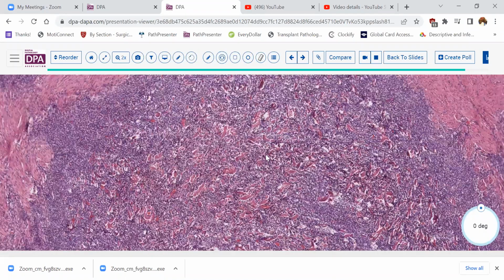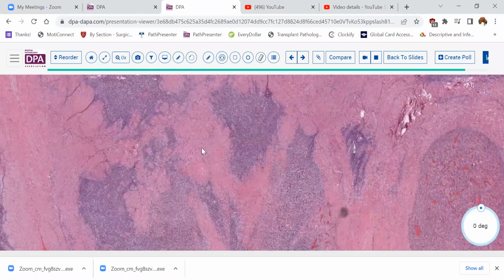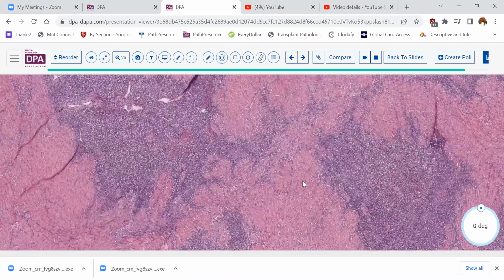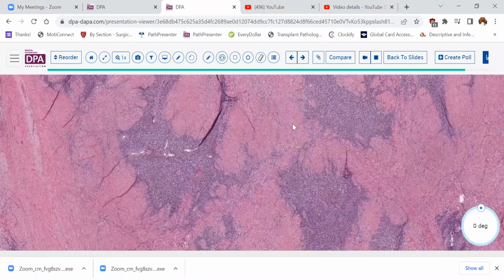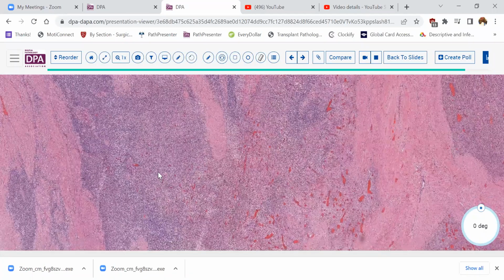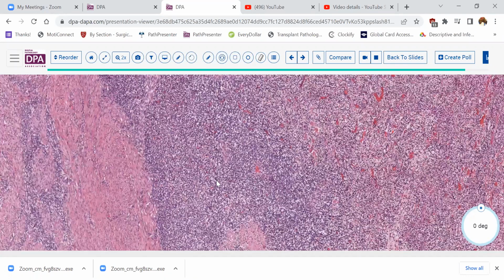So the differential diagnosis for this type of a tumor in the uterus would include things like endometrial stromal sarcoma, maybe intravascular leiomyomatosis, although this is with a very cellular leiomyoma component. But by and large, this and the other possibilities would be things like adenomyosis with sparse glands, things of that sort. So the vascular pattern certainly is fairly suggestive of an endometrial stromal sarcoma, along with the infiltrative pattern.